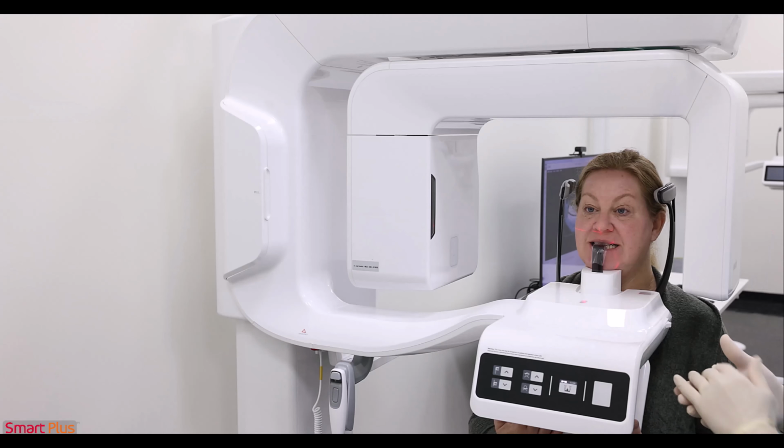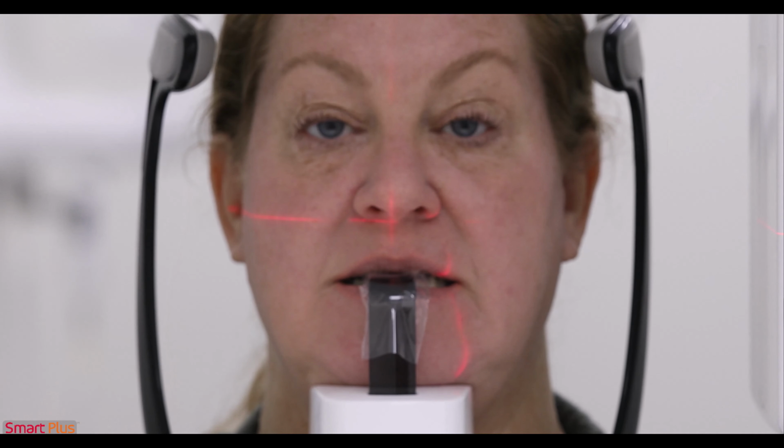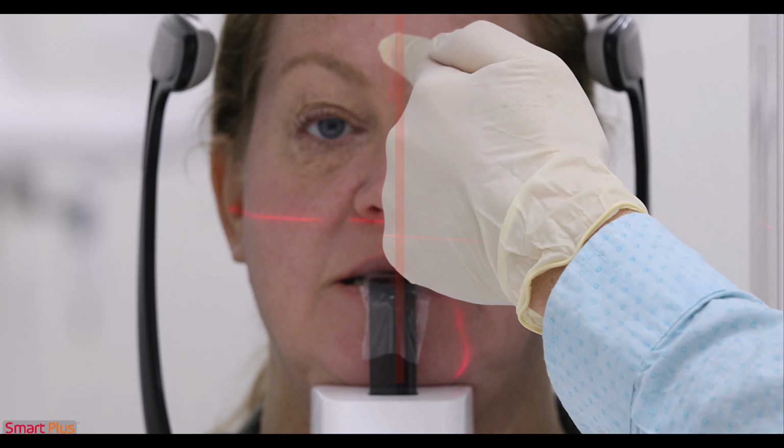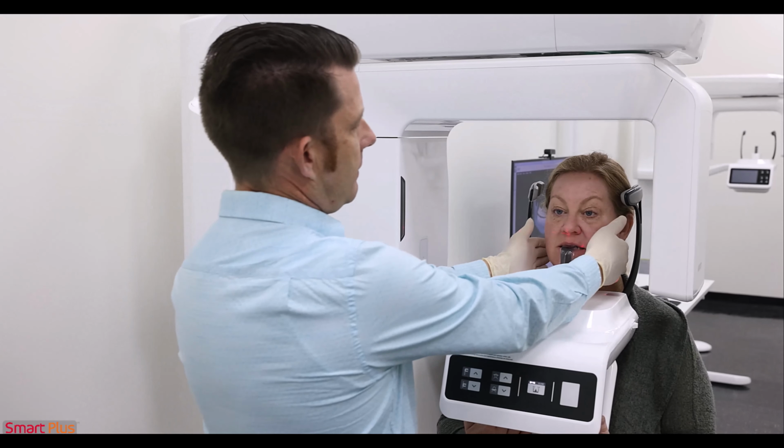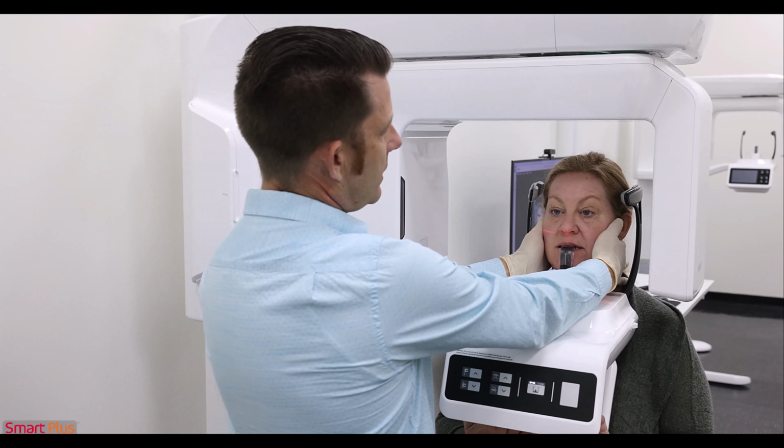So, 3 steps in positioning for our panoramic. First, I'm going to start with my mid-sagittal beam, ensuring the patient is lined up center, looking right between the eyes and right through the philtrum. If I do need to move that, I'm going to go ahead and physically move the patient's head to make sure she's lined up center.